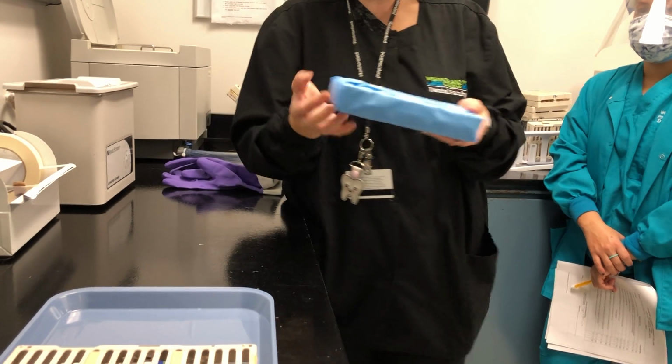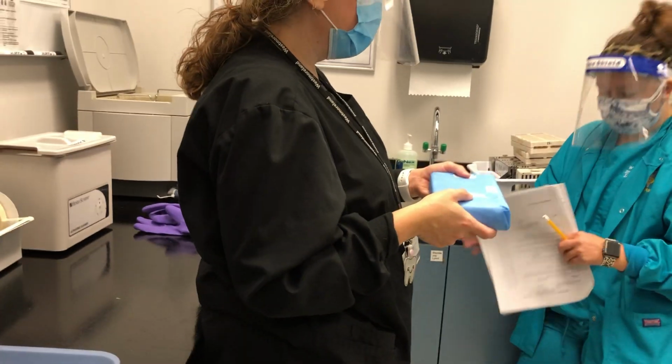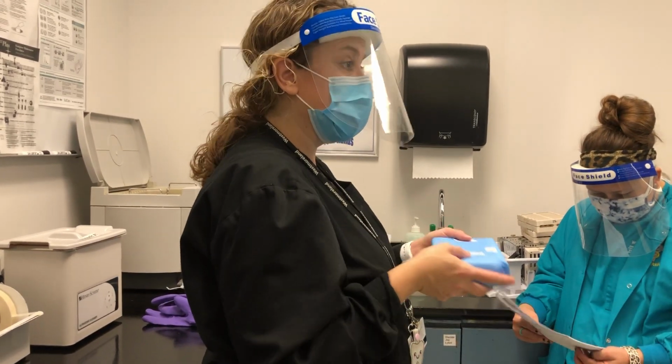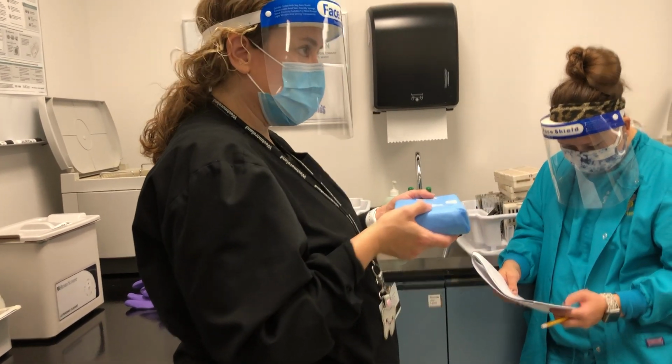Okay, so now that we have our completed wrapped cassette, once again, this is not sterile, but it's also free of the germs that were on my utility gloves, okay? So you can handle this with your bare hands, okay? Then where am I going to take this? What's the next step?